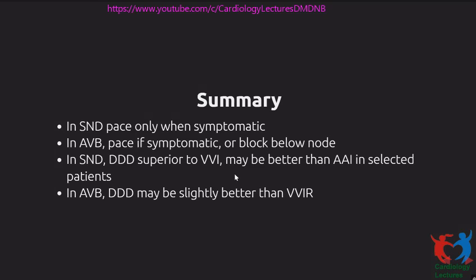And when it comes to mode of pacing, in sinus node dysfunction, definitely do not pace VVI. That should be a key message. Do not pace single chamber ventricle in patients with sinus node dysfunction.